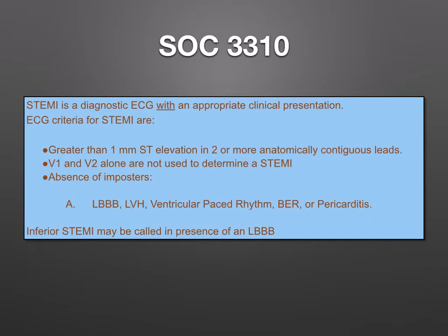When you look at a left bundle branch block in someone having no symptoms whatsoever, going about their business, having a wonderful day, it creates ST elevation in the anterior septal leads. That looks like an MI, even though it may not be. It does not, however, create ST segment elevation in the inferior leads. And as a result, if you see an inferior STEMI with a left bundle branch block, that elevation in the inferior leads is not caused by the left bundle branch block. Therefore, assuming you have the right clinical presentation, that would be a STEMI.